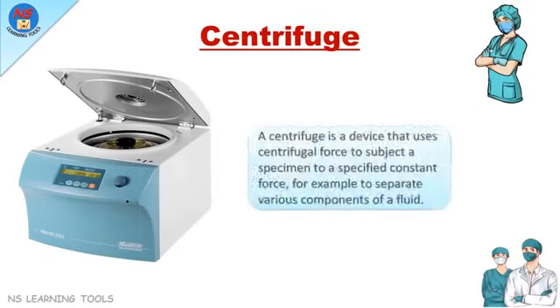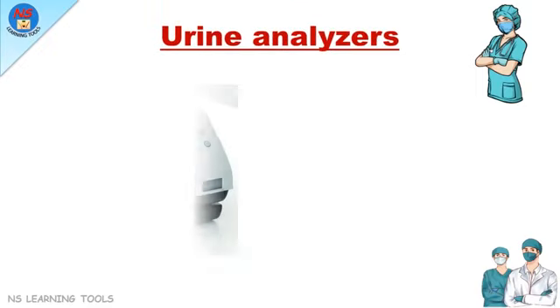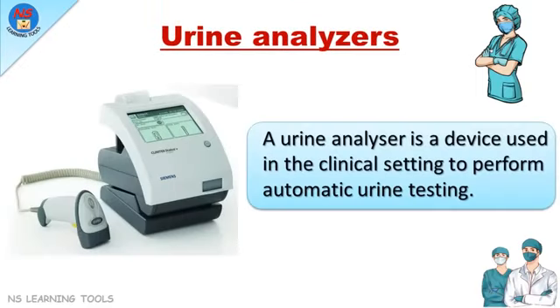Centrifuge. A centrifuge is a device that uses centrifugal force to subject a specimen to a specified constant force, for example, to separate various components of a fluid. Urine analyzers. A urine analyzer is a device used in the clinical setting to perform automatic urine testing.